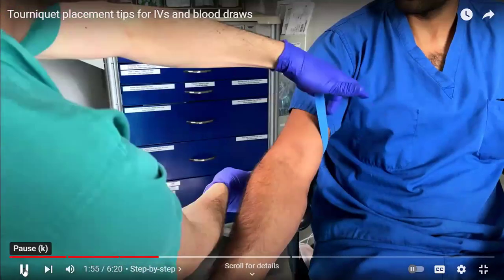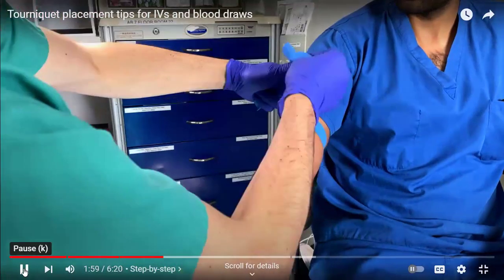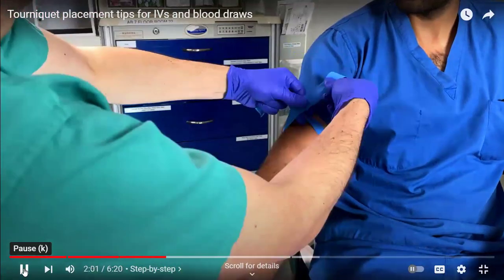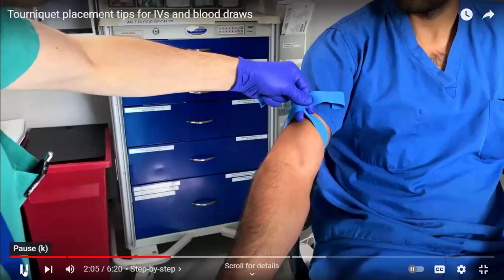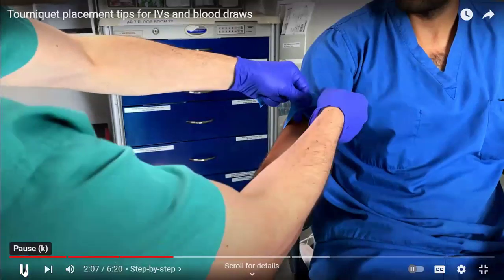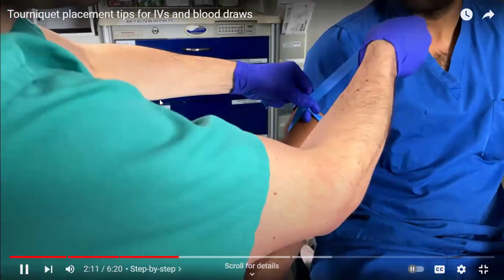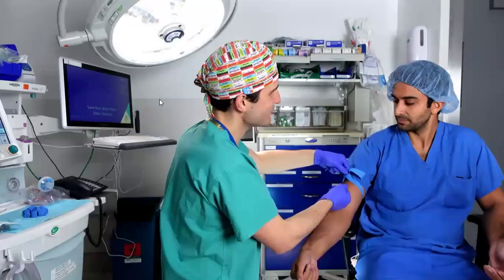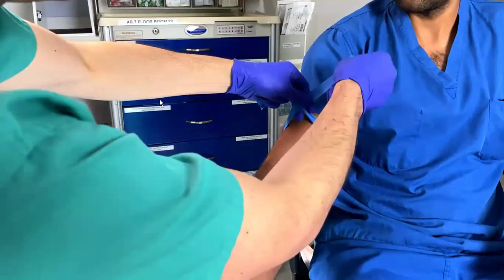That allows me to use the other strap and place it in between my thumb and my index finger using just my left hand. That allows me to keep my right hand free to manipulate equipment and also to adjust the tourniquet. You can see that it's very easy for me to tighten the tourniquet by pulling on the end that is closest to me.